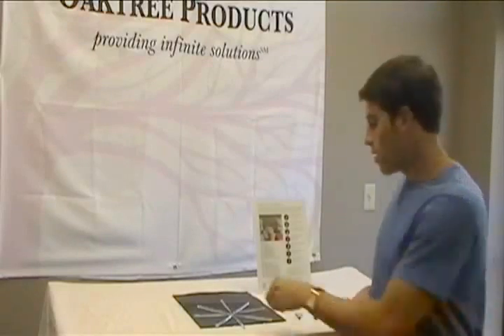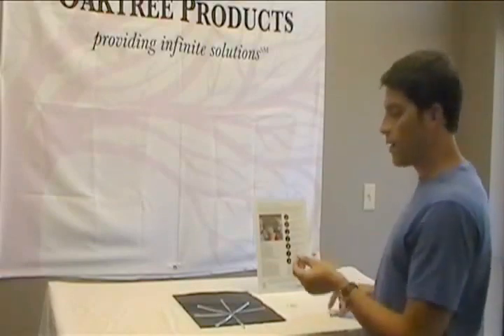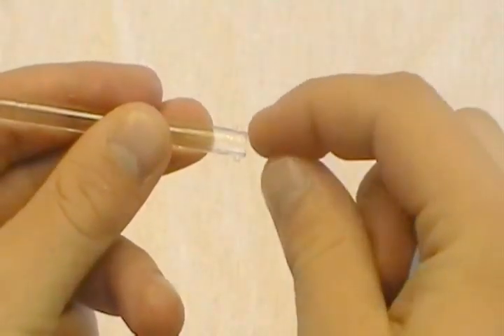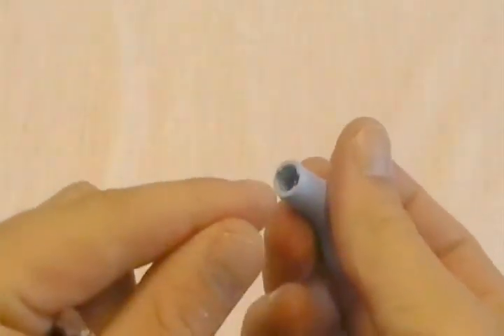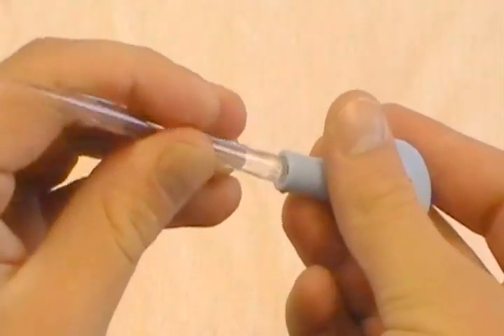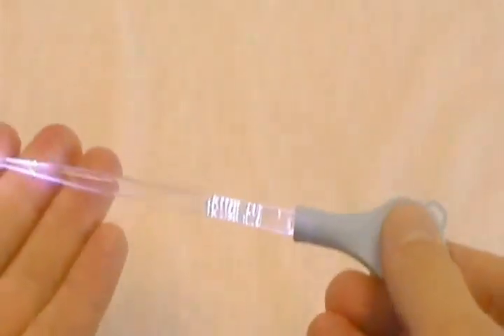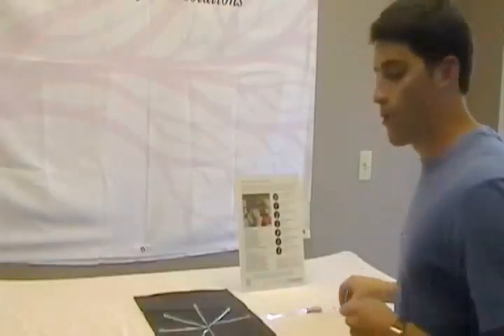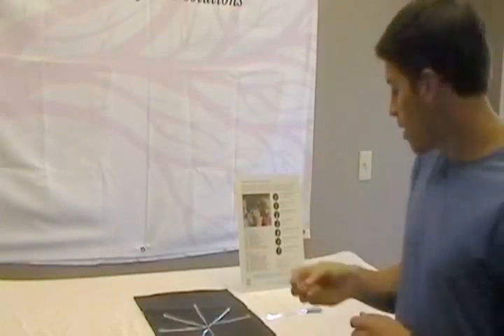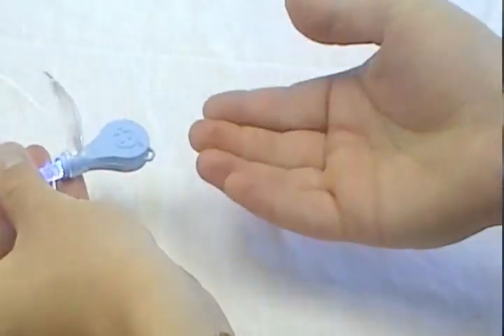Now we're going to assemble it. We're going to take the curette and the light source and we're going to align the pegs of the curette with the grooves of the light source, push the curette down, twist it to lock it into place, and then we're going to take the magnifier and attach that to the neck of the light source.